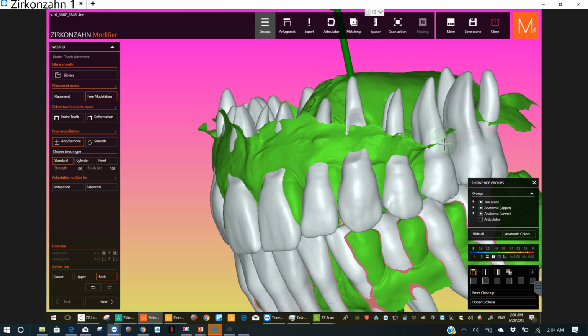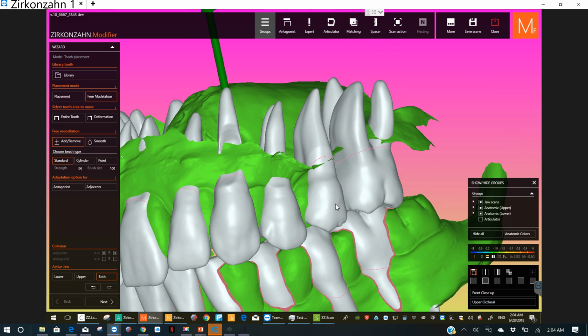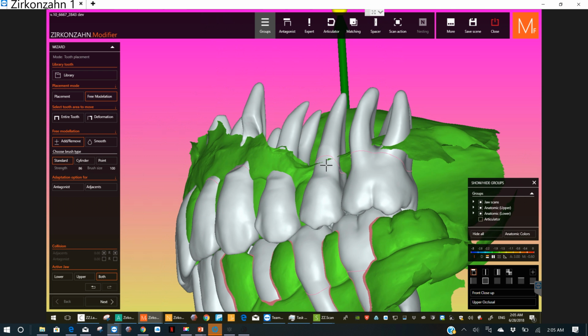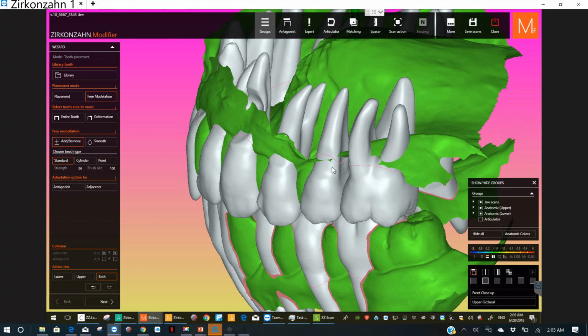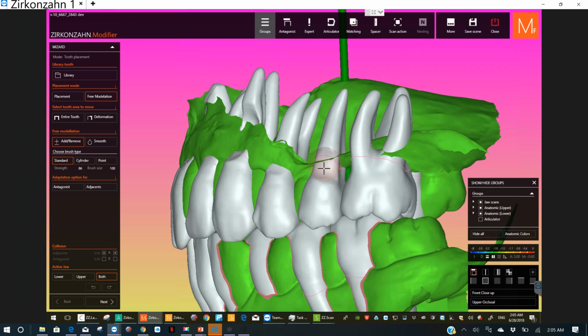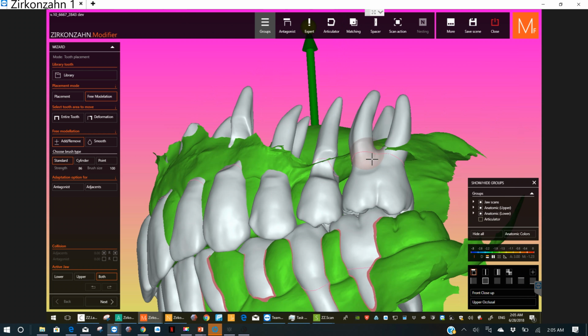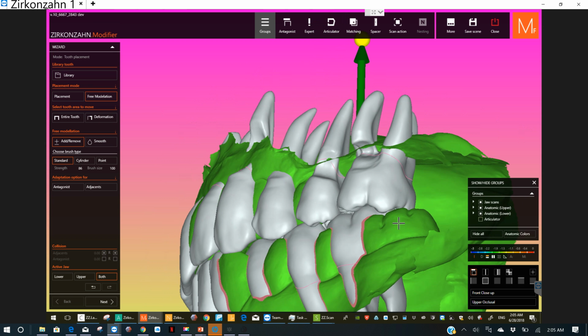One thing I know is a no-no in any CAD/CAM program is having a tooth hang over the edge of the scan. So this is going to have to be a little bit of a compromise area because we don't have a good scan. So just make sure you over-exaggerate and get out as far as you can. Okay.